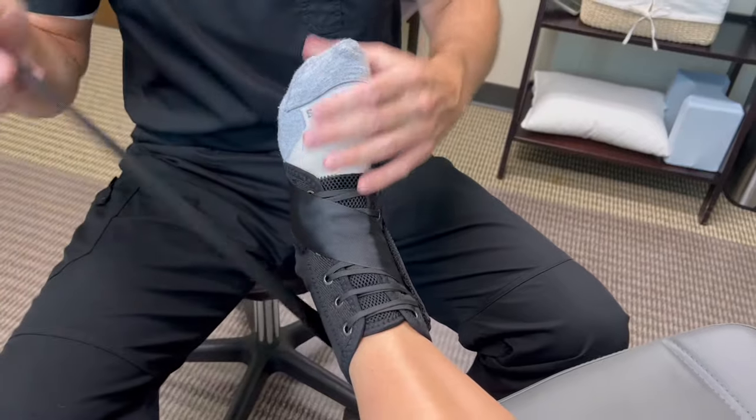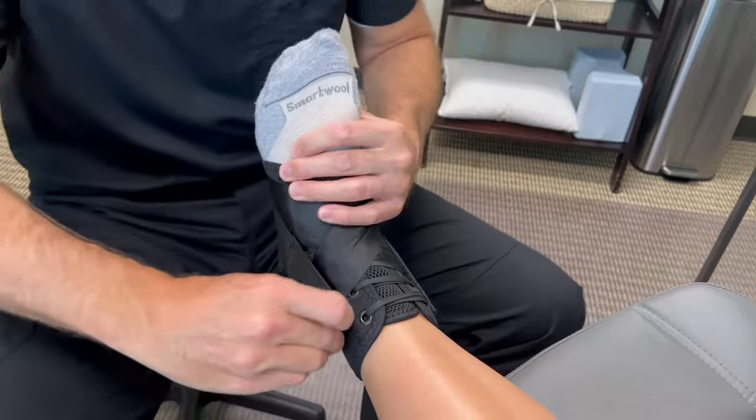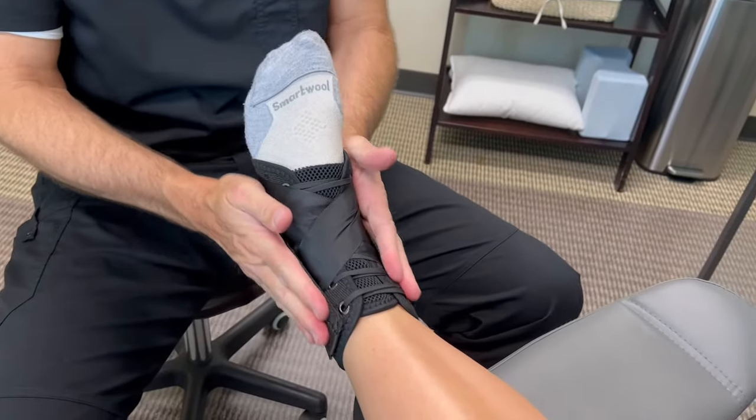The same thing on the other side — you're just gonna hold the foot in that position and slide that around, and it sticks on like that. Really, that's it.